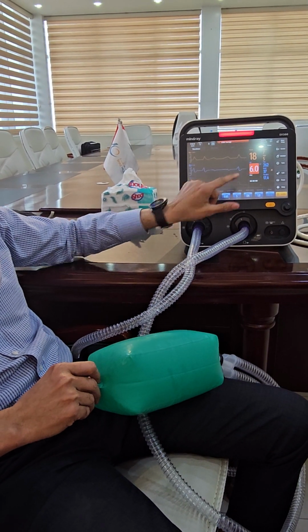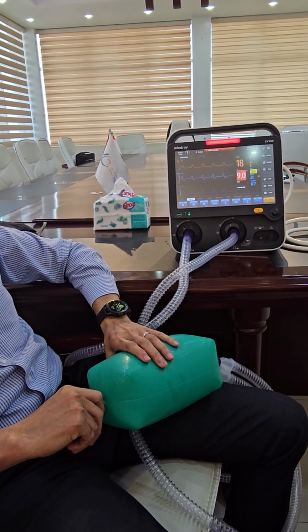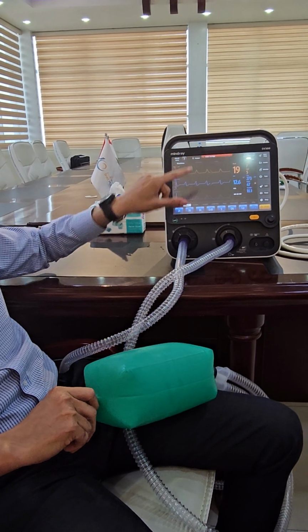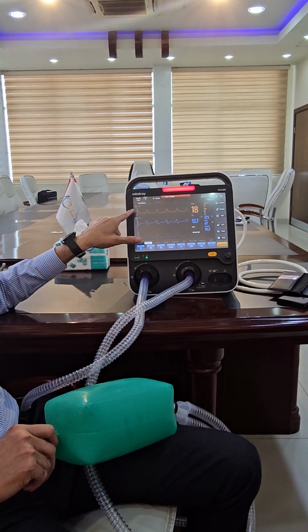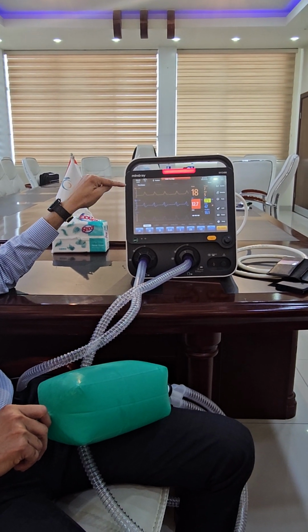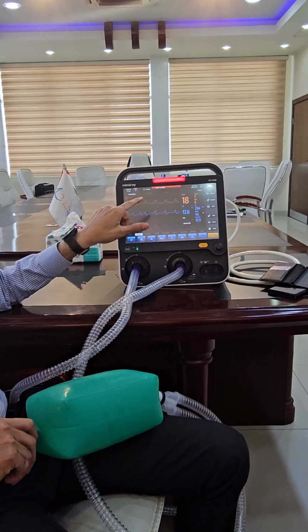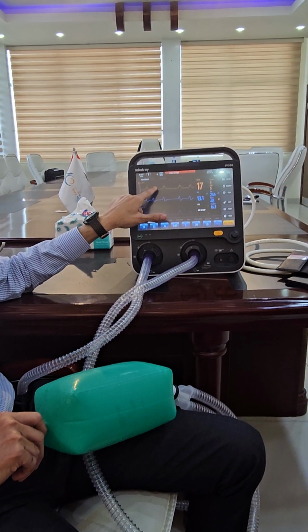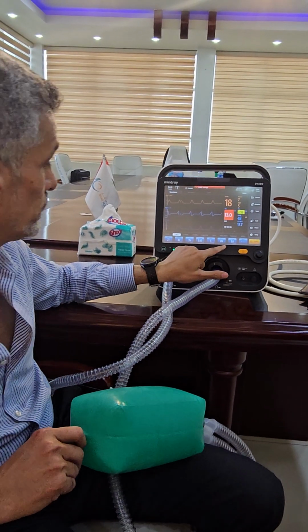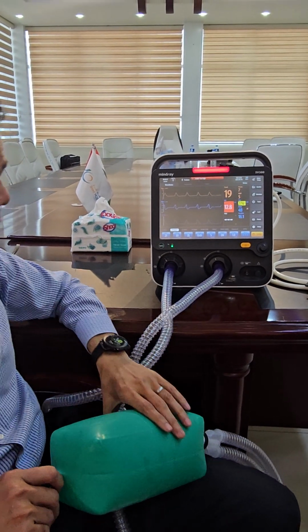You see the wave? You understand the difference now between volume and pressure by the wave, but we are looking at the graph. What is this, a graph or loop? This is a loop. What is this? This is a graph, because it's a parameter against time. Usually you see 3 parameters: pressure, flow, and volume. This is a loop, a parameter against parameter. This is pressure control, because we determine the pressure. How much pressure do we put? 30. Okay?